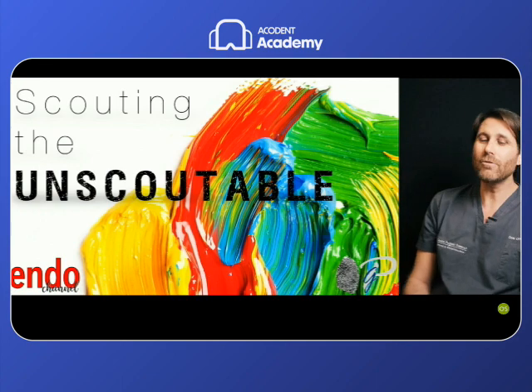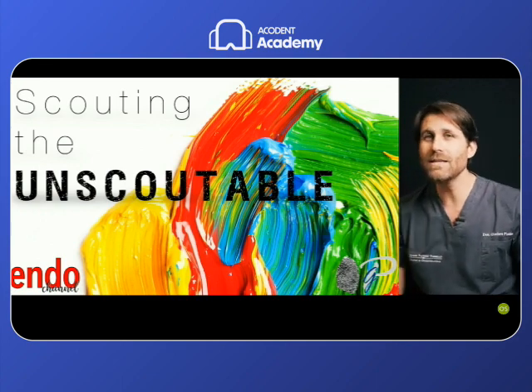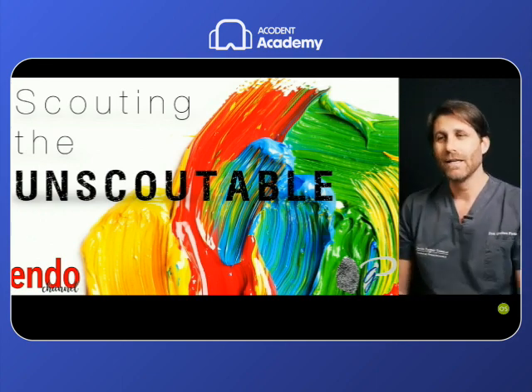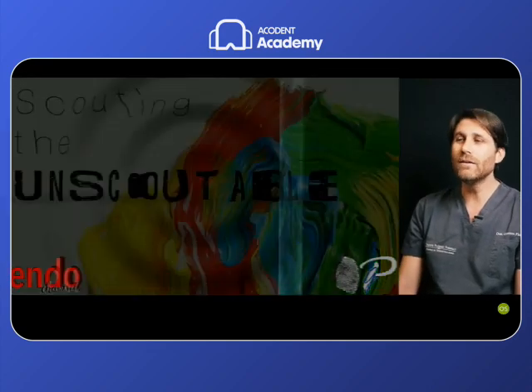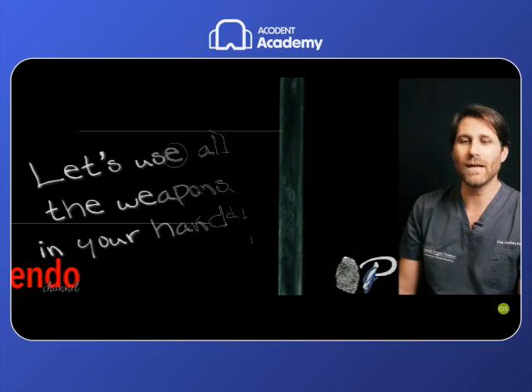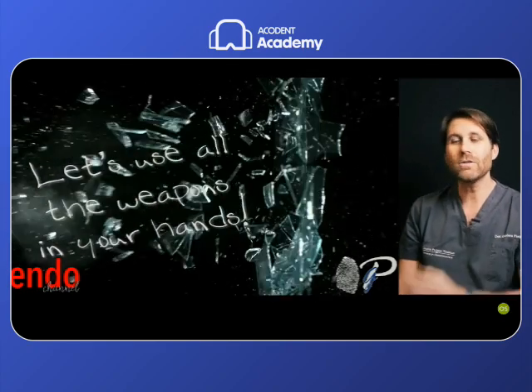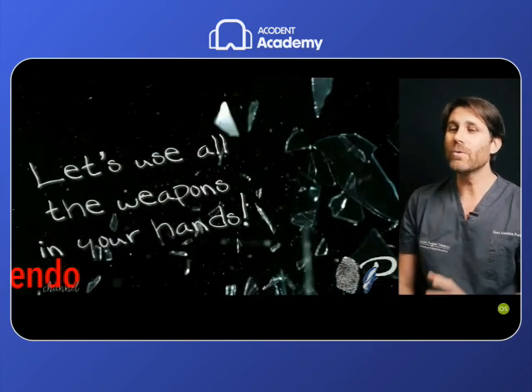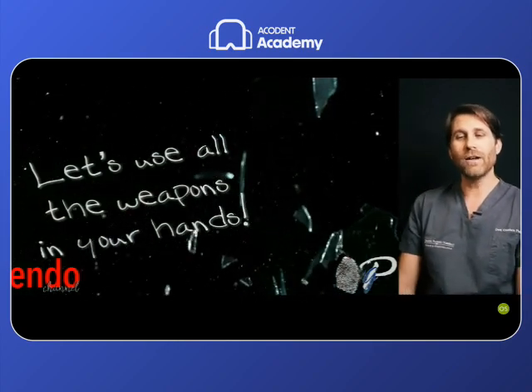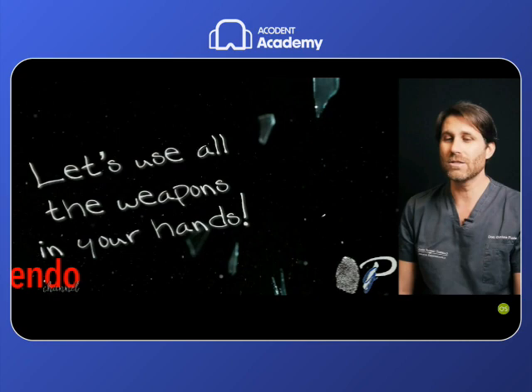So, to scout the unscoutable root canals, this is the aim of this lesson. And in scouting the unscoutable root canals, in some cases we need to use all the weapons that we have in our hands. Those are some really particular, very difficult cases in which we can join the different weapons, the different instruments that we have.